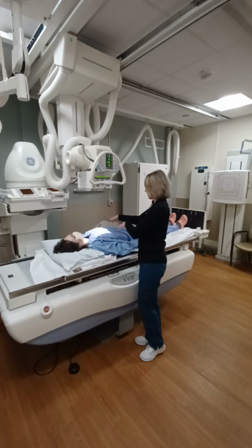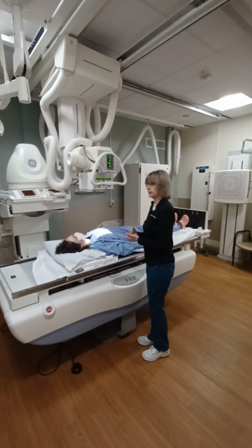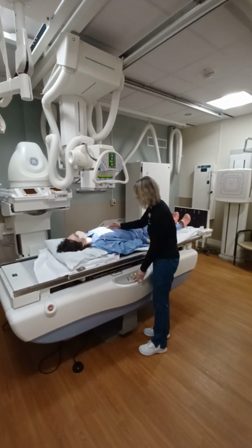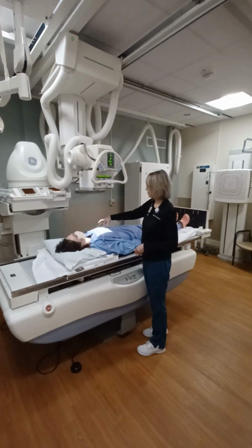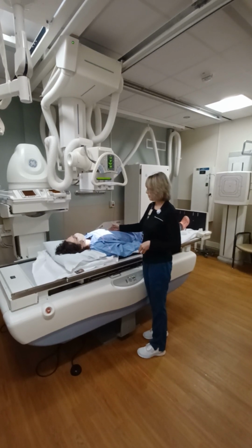Okay, so patient here, average size, so sthenic body habitus, we're going to center at L1. You can center directly down the MSP, or some people do prefer to center slightly to the left because that's where the majority of the body of the stomach is, or you can center down the MSP.